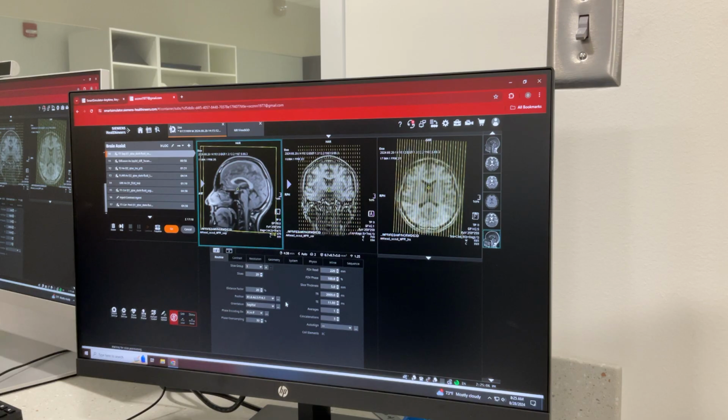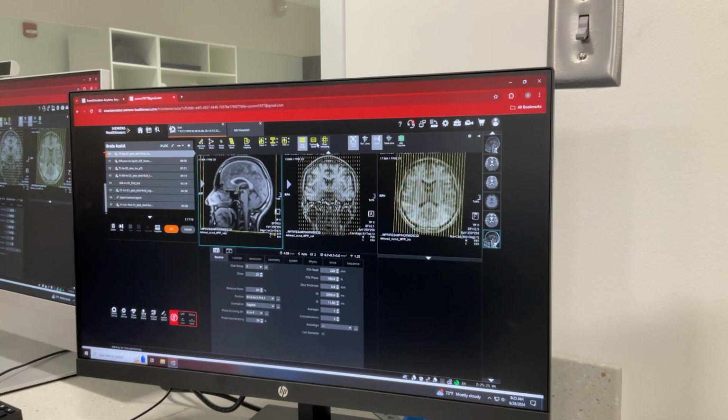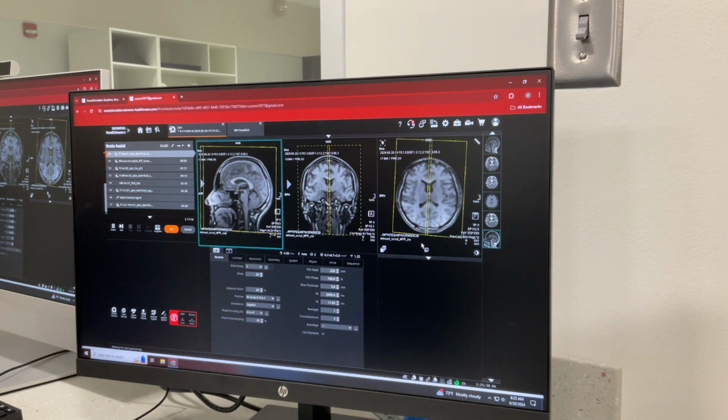So if we're looking at the axial reference image and the coronal reference image, our slices should be parallel with the longitudinal fissure, or our falx. And I like how she just took her slices off, now she can see it better. She went up, did that line mode, took her slices off, and now she can angle right down the center of that.